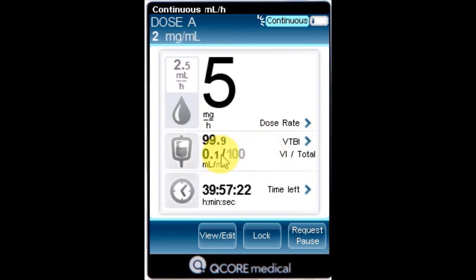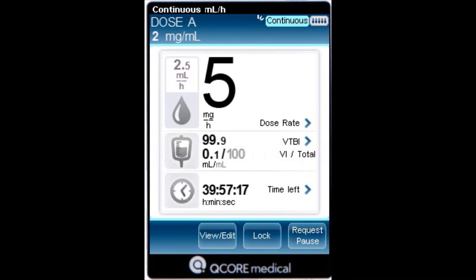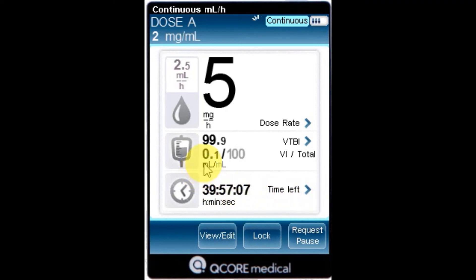VI over total: the total volume delivered in a current infusion, including the KVO if applied during a delayed start period, over the total VTBI programmed. As the infusion progresses, the VI increases and the total remains constant.